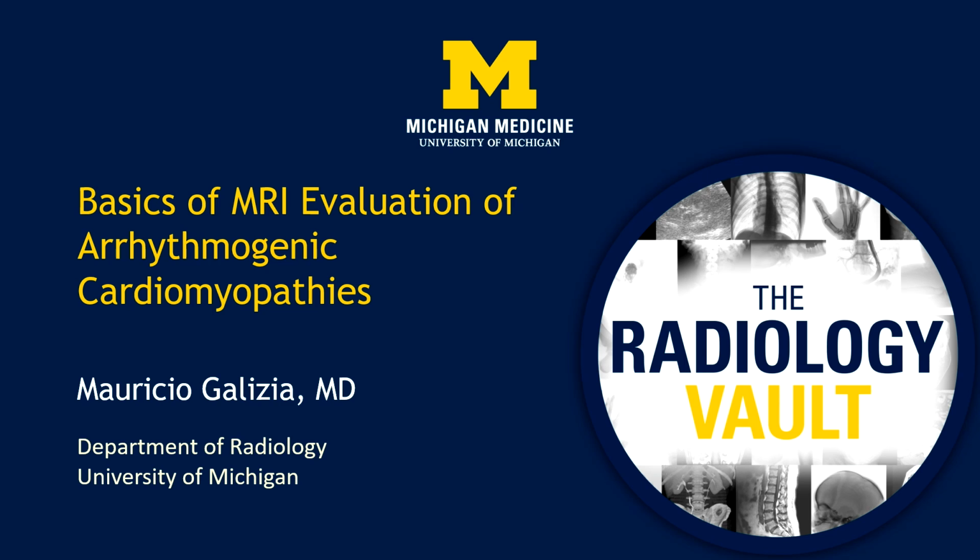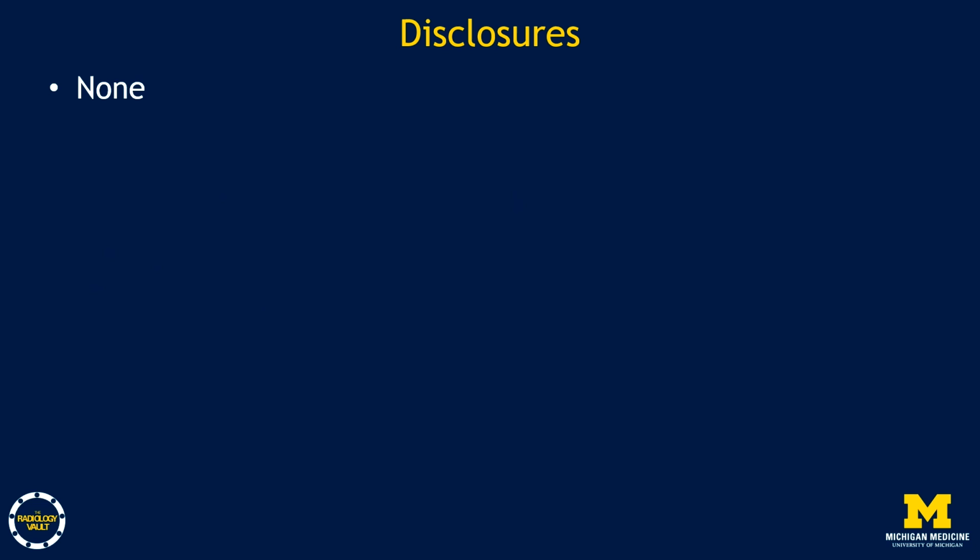Hello, I am Mauricio Galizia, a cardiothoracic radiologist at the University of Michigan. Today, I will cover the basics of diagnosing arrhythmogenic cardiomyopathies using MRI. Before we dive in, I have no disclosures to mention.